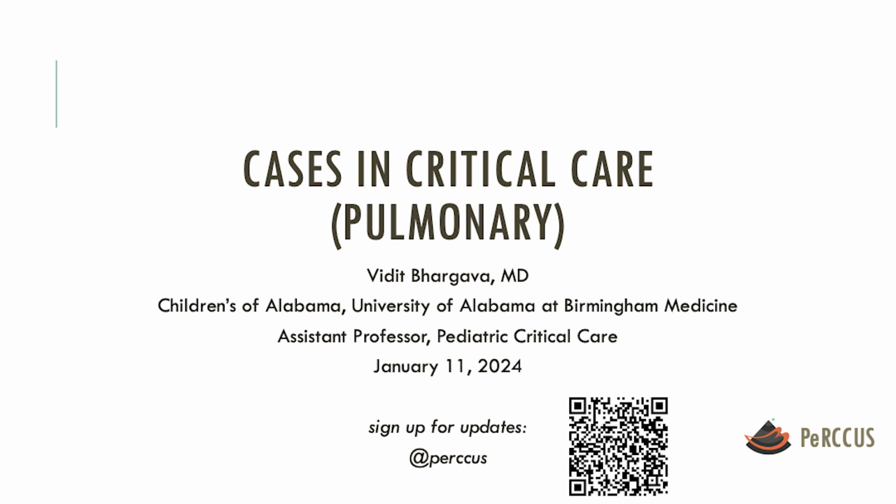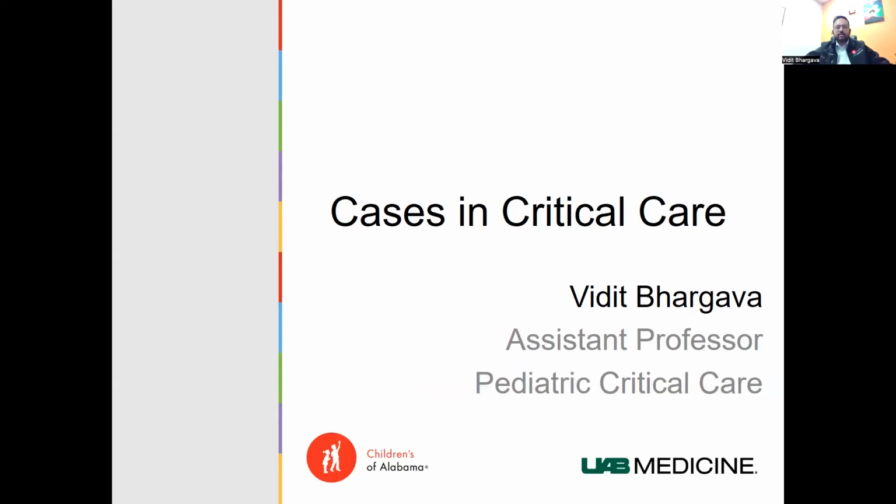So the idea for today's presentation is that it's helpful once in a while to try and string together everything we've learned and put it in the context of how we are going to apply it at the bedside. These cases are all focused on lung ultrasound because in the past, Eric has done some cases on cardiac ultrasound, and we talked about volume responsiveness. So this is mostly focused on lung ultrasound.